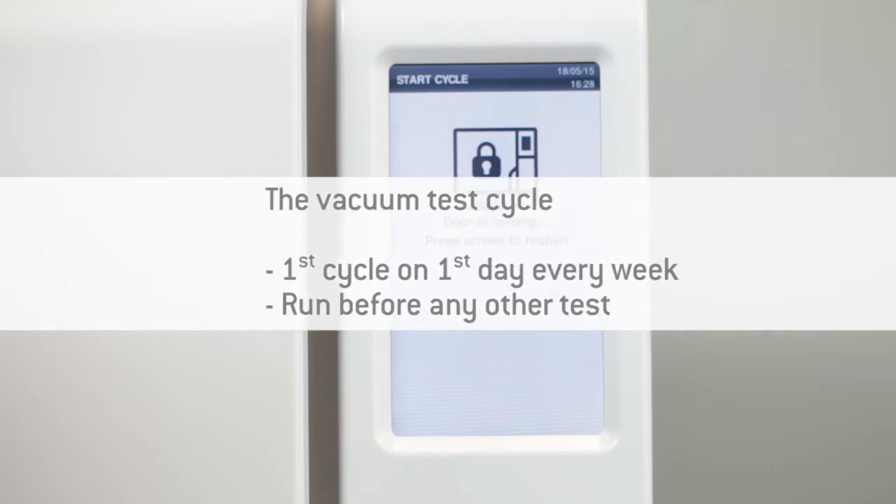The vacuum test should be carried out before any other test, such as the helix test cycle or a normal cycle.